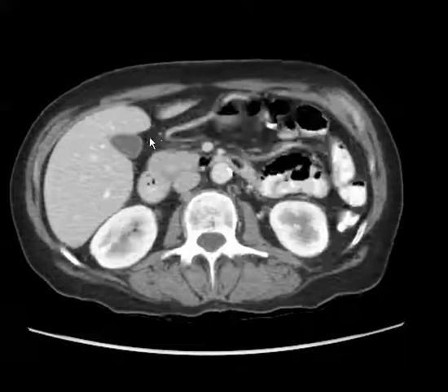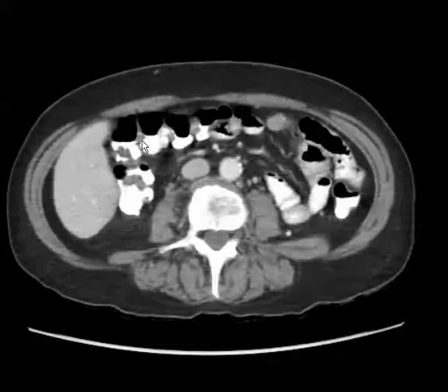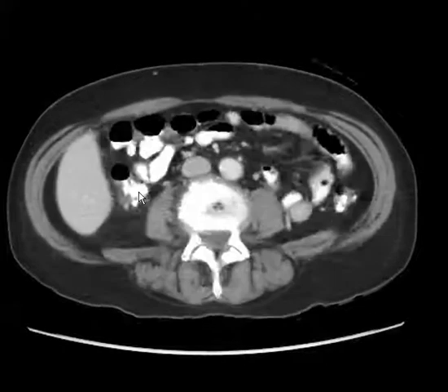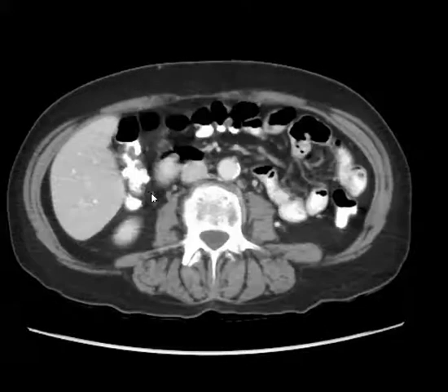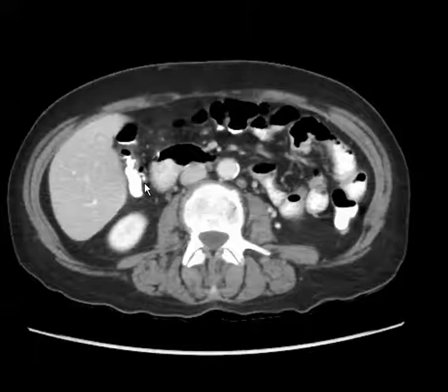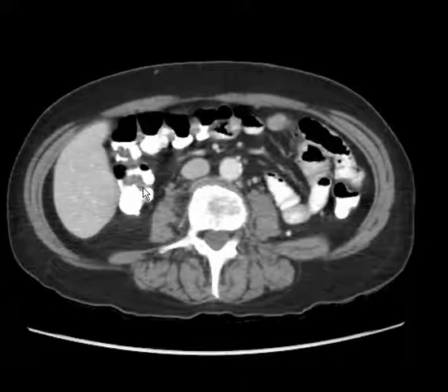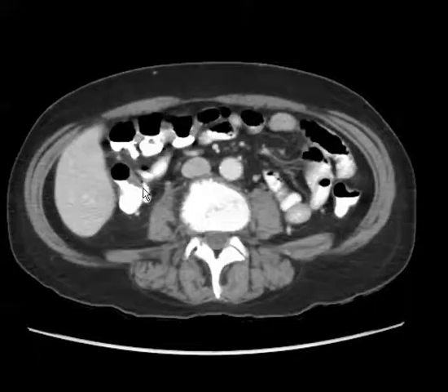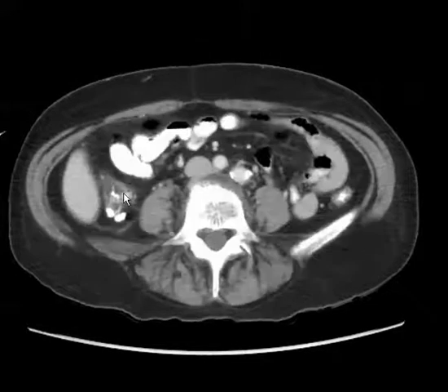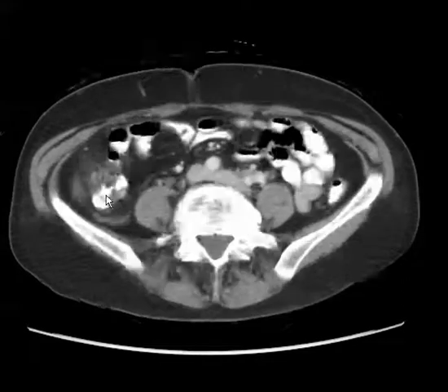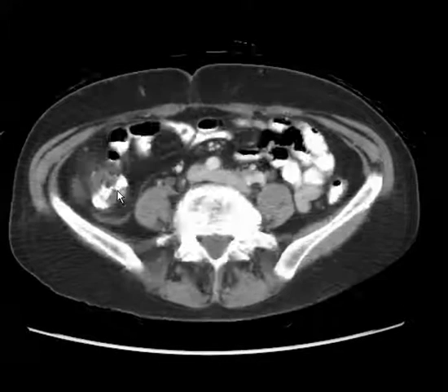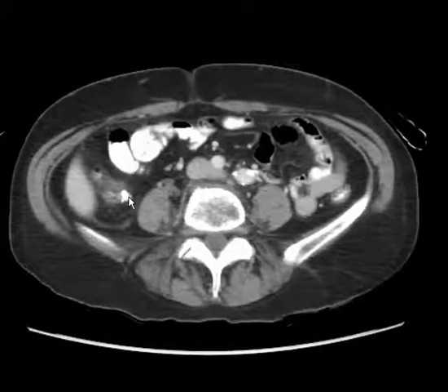As we scroll down these images, notice already that we are seeing some colonic diverticuli arising off of the cecum and the ascending colon. As we scroll more inferiorly, notice that there is wall thickening of the cecum and some fat stranding surrounding the cecum, and we continue to see more diverticuli.